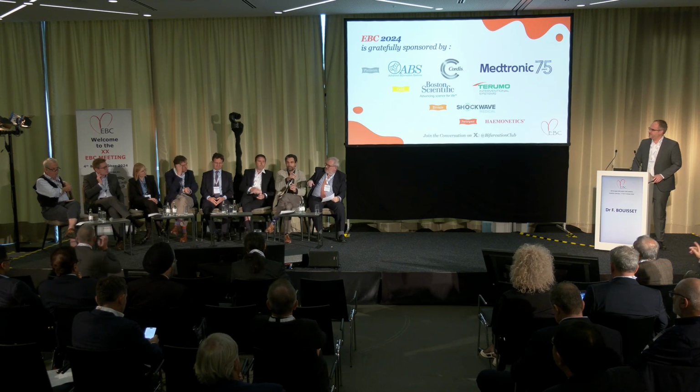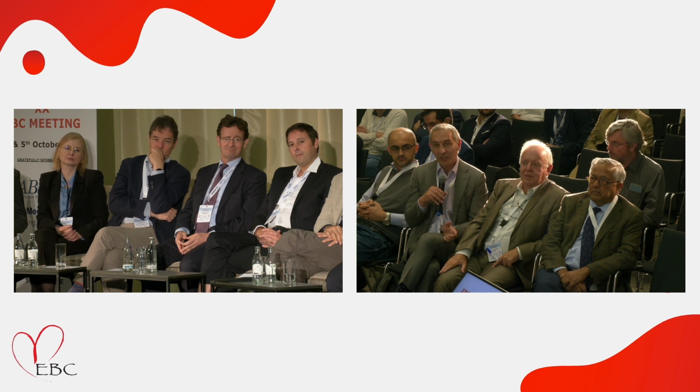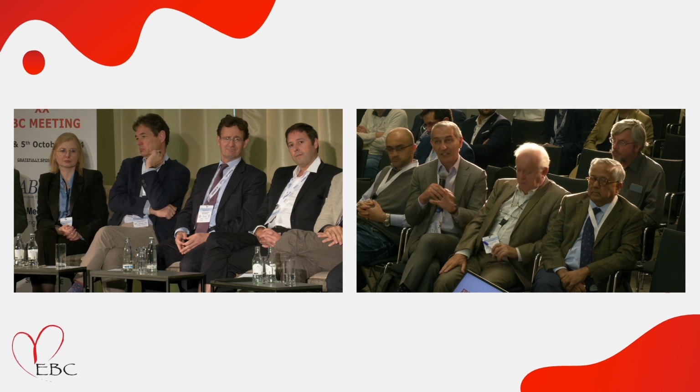Patrick, just one question. I want to say that the message about the journey that you gave us is to always go back to history and ask where we have come from with angioplasty and stents. There's no question that CT is the next frontier, and some of the software, Carlos, that you and others are working on is going to be critical for that. I do think that today CT is going through the same process that angiography went through 20, 30 years ago, where image quality does matter. If you've got a 64 slice, 128, the acquisition parameters, the amount of contrast, the artifacts, all those things: garbage in, garbage out.